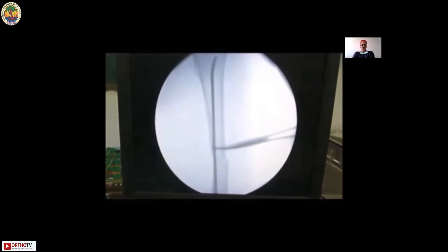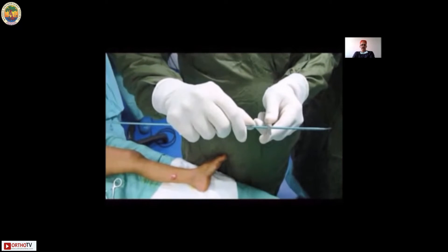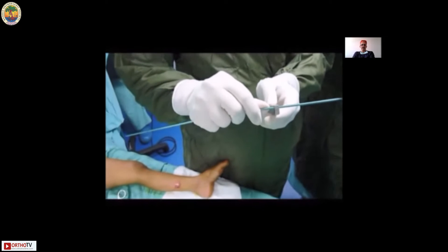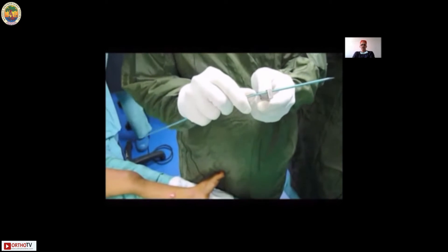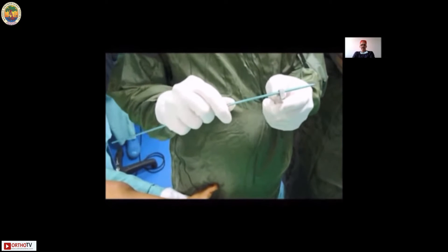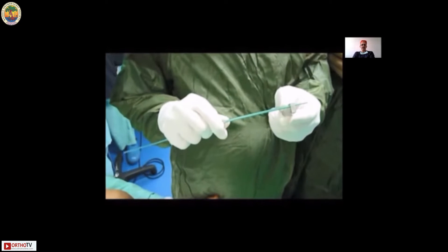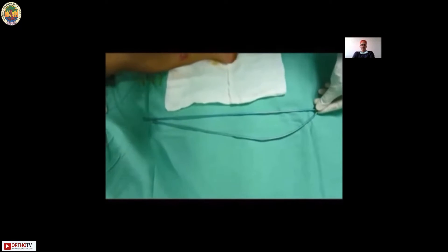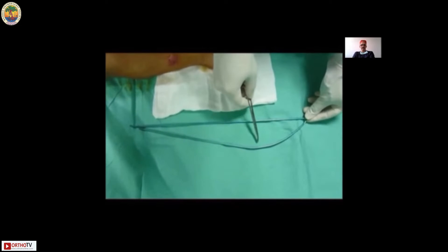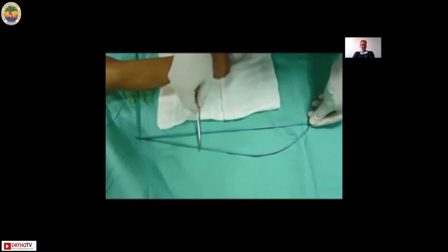Then I need to bend the nail. With an artery forcep, from the seating point which is the intertrochanteric line, I'm going to choose where my apex of the bend should be, and I will bend the nail along the curve of the hockey stick. I will choose my apex first and start bending from there, bending gradually on either side of the apex. The height of the bend should be three times the canal diameter — for example, if it's an 8mm canal, this height should be 24mm. Equal bend on both sides; the rest of the nail can remain straight.